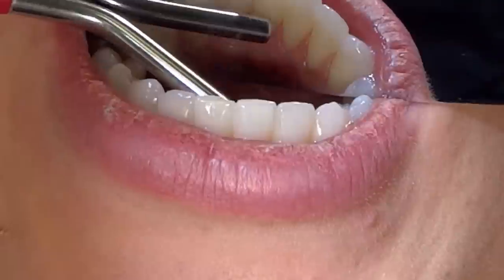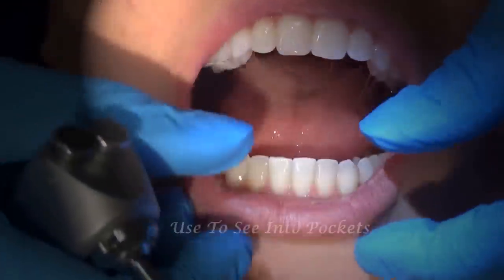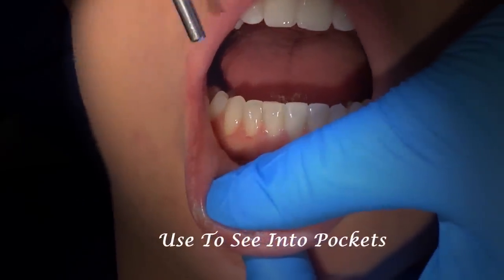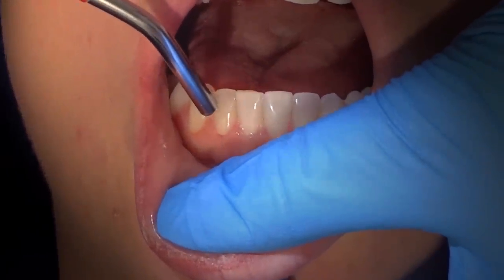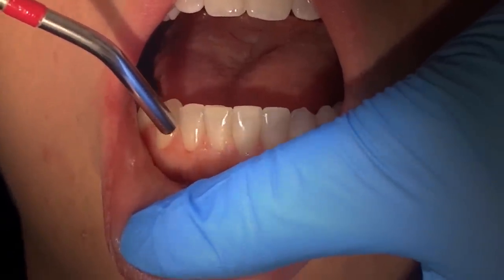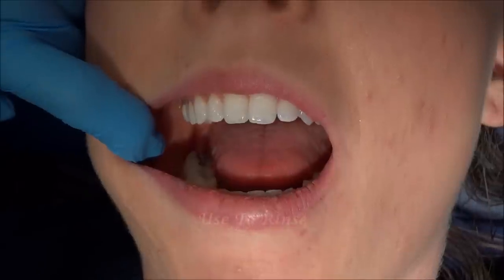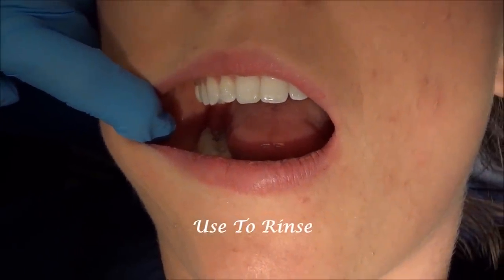When you're doing periodontal debridement and you want to see down into a pocket, just use the air directly down into the pocket — point it right towards the sulcus. The pocket will actually deflect open so you can see down into the base of the pocket.